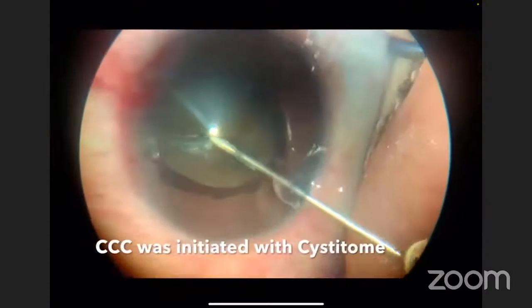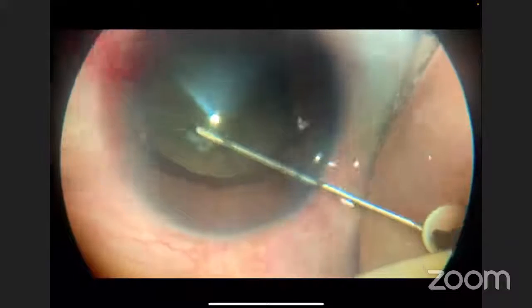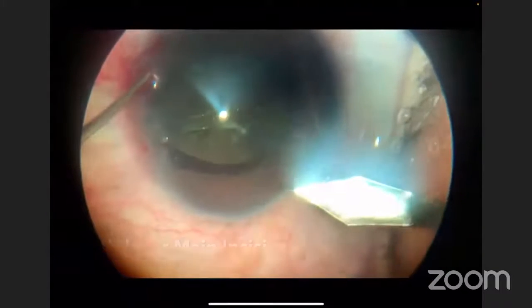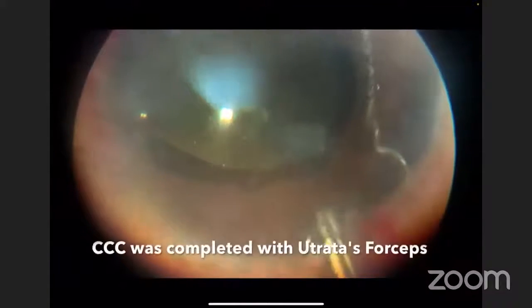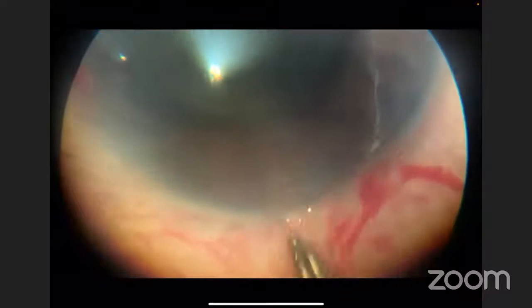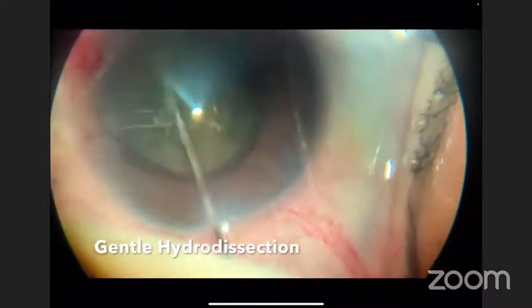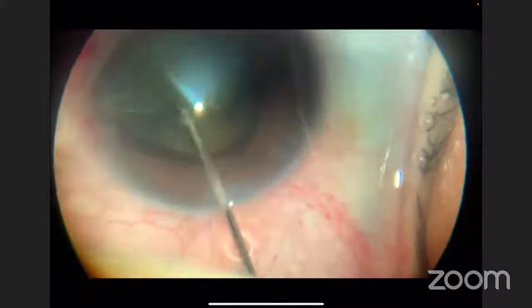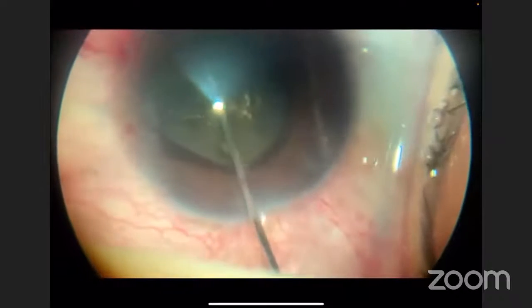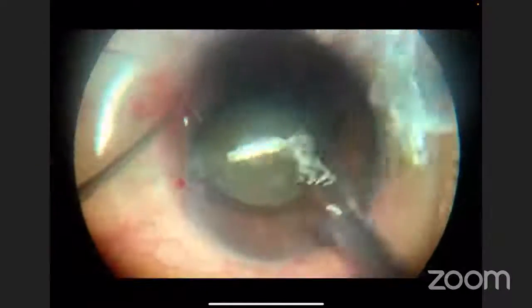Now this is a regular capsulotomy. While you are working under the tube, many times you will find there is fibrosis and you try and pull and it doesn't come out. So using Utrata's forceps is beneficial in such a scenario, and then you can complete your rhexis. Good hydrodissection with delineation is important, but again, you need to be very, very careful that you don't push the tube up towards the cornea so that you don't have any endothelial cell loss while doing this.